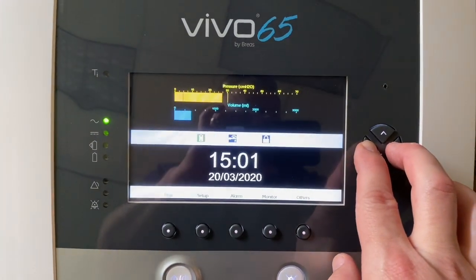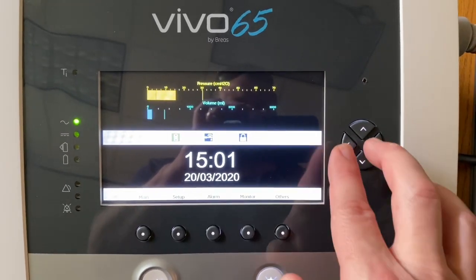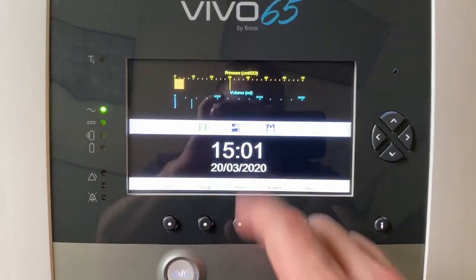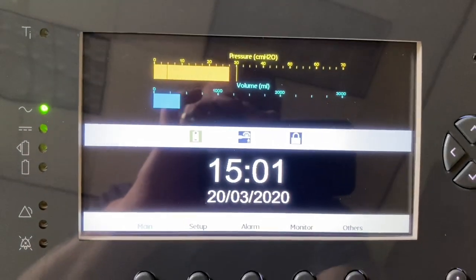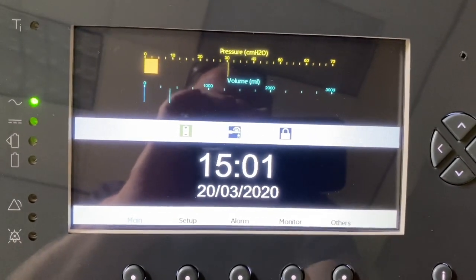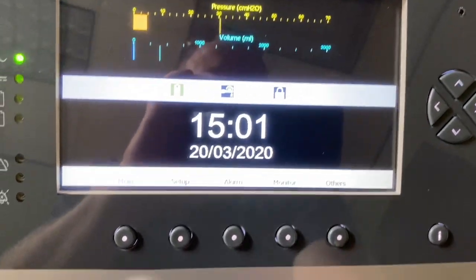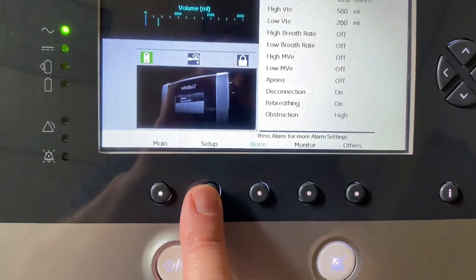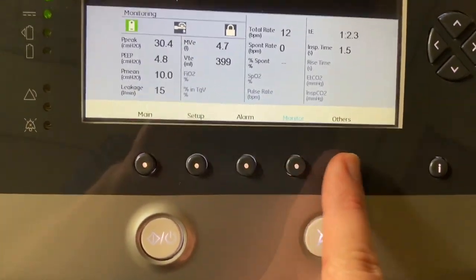Pressing and holding the handshake — that's the left arrow and right arrow simultaneously — and allowing that bar graph to fill, will then lock your ventilator out when you go back to the home screen. That way you don't have to worry about a patient or caregiver coming in and accidentally changing prescription settings. They can view things, but they can't really do anything else.